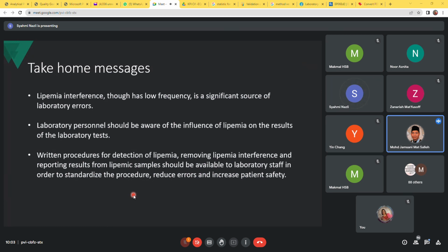So don't make it limbo, some sort like first time datang to hospital or KK, we reject it, and then patient turn up again, or come back the second time, we still reject, or we keep asking for a new sample, end up that patient don't have any clear clinical condition as well as that warrant for screening for other family members.